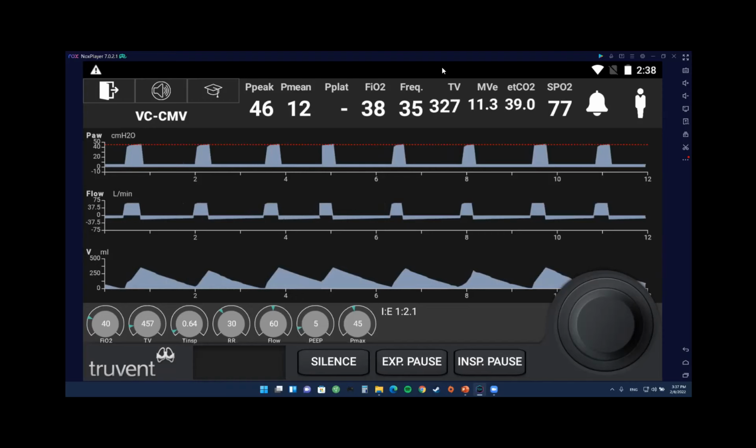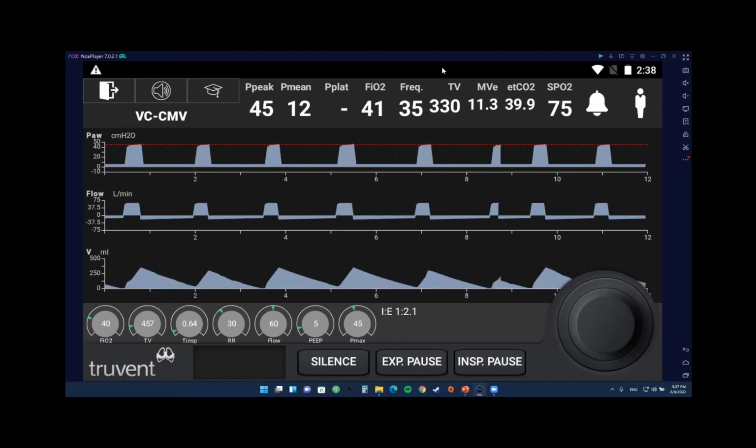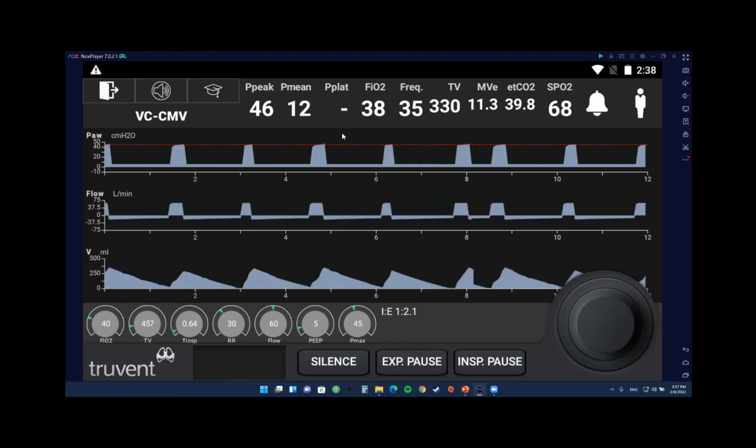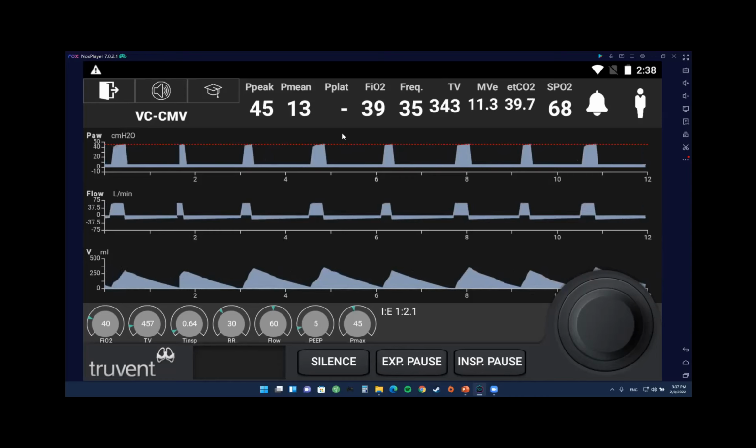Maybe like a mucus plug or. Darren? You said that as you're suctioning, it's stuck halfway through the endotracheal tube. Yeah, it's not going through fully as it should. That means that there's some sort of physical obstruction there. Correct. The question is, what is that physical obstruction?